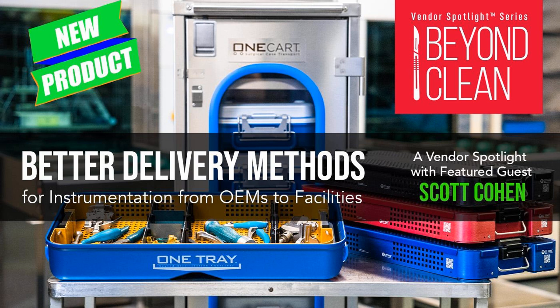Now, I want to say condense, so everybody understands condense versus removal. We're just taking all the instruments and all the dead air space that are in those 7 trays, and we're reducing those down to very compact 1-level sets in the 3 tray configuration. So you're getting 3 single levels versus 7 outer and inner trays plus 11 levels of instrumentation involved in that. And that's the goal. It's to deliver that.